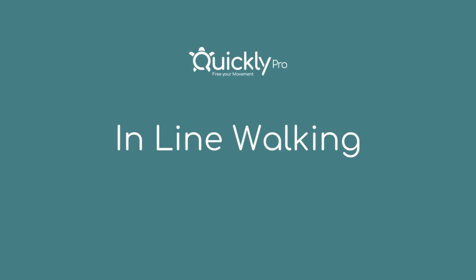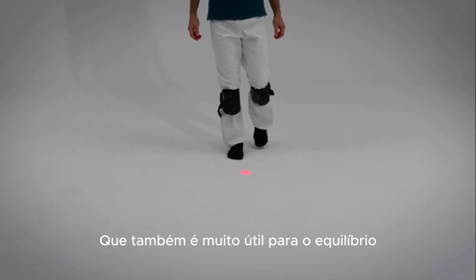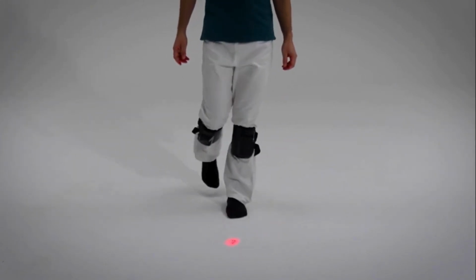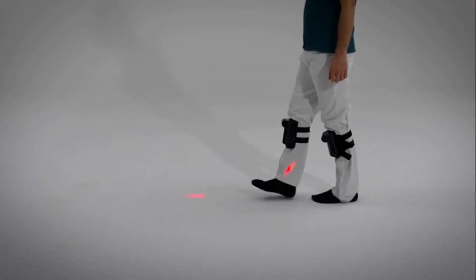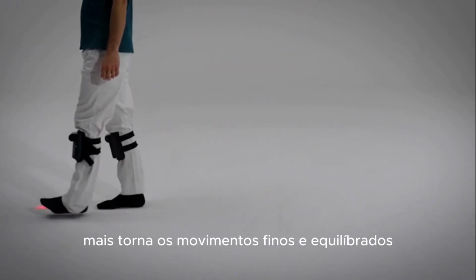Inline walking. Typical gait training exercise that is also very useful for balance, coordination, and proprioception. Visual feedback stimulates the patient to concentrate on executing the precise movement. Speed of execution: the slower it is, the more you seek fine movement and balance.